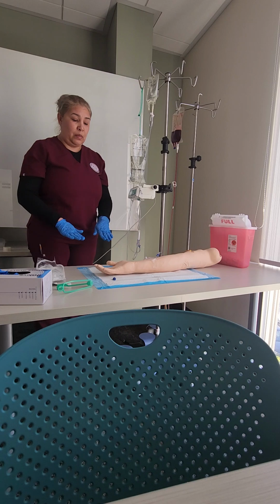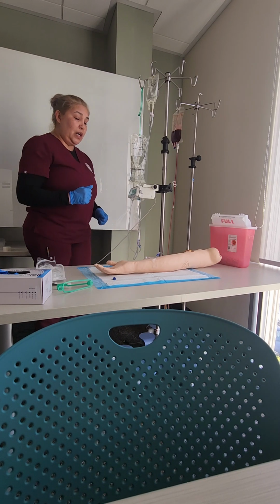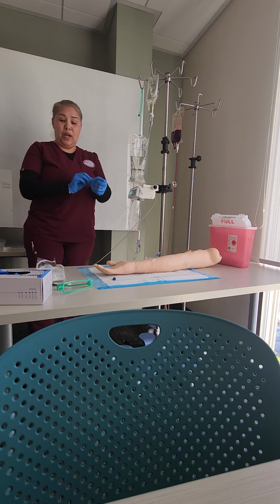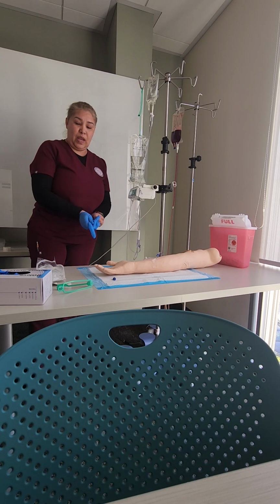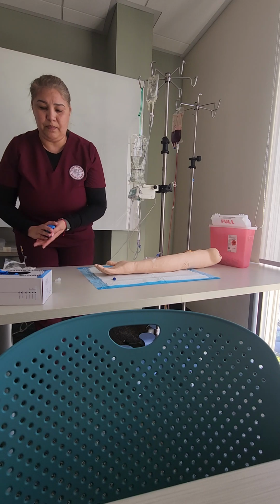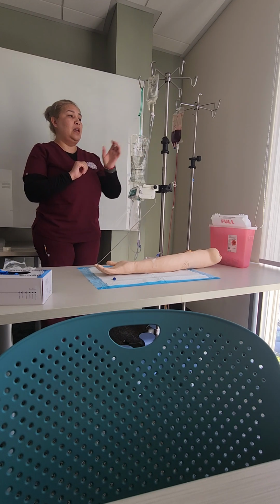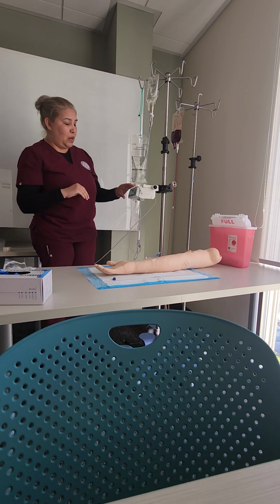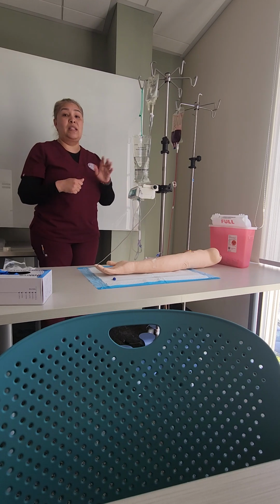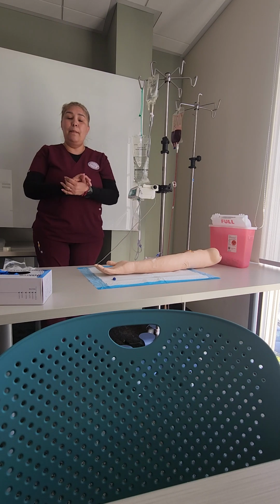What I want to do now is make sure that I bring the bed all the way down, that the rails are up, that the bed is fully locked, that my patient is fully comfortable. I want to clean up everything that I was working with, get rid of all the trash, throw everything where it needs to be thrown. I want to perform hand hygiene, and again, evaluate my IV before I leave. I want to make sure that my pump is plugged in or has enough battery. Yeah, I am all set.